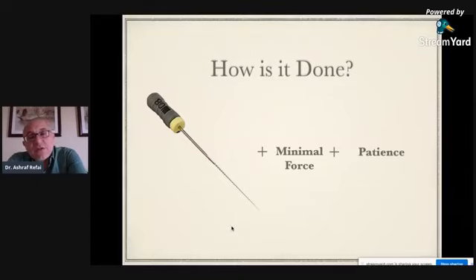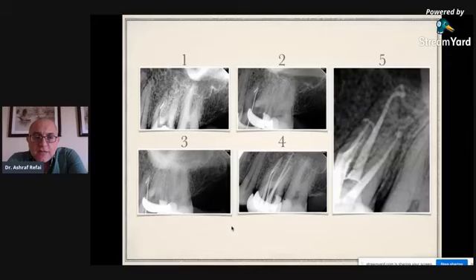If you begin your procedure with the intention of drilling next to the fractured instrument, then you are probably going to perforate this root. So here is a case. This is a very, very tough case. This was an upper 6. And you can see in X-ray number 1, an instrument fractured ahead of the curve. I started finding space between the instrument and the canal walls.